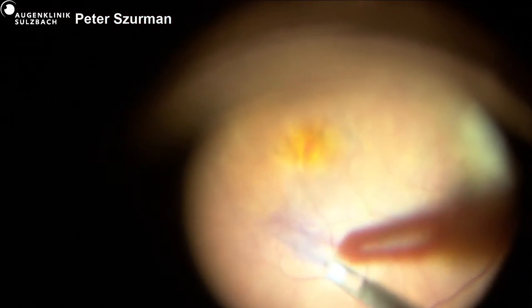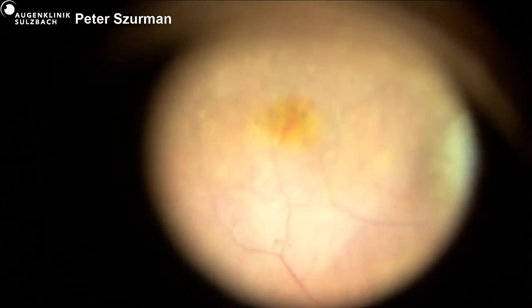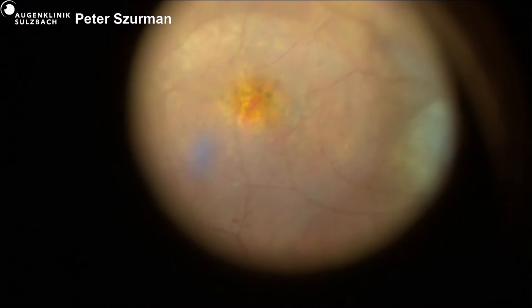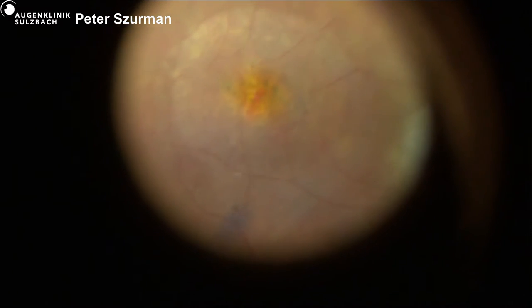So with these adherent edges, we now have to approximate the edges. So the peeling is done. Peter, the preoperative OCT.